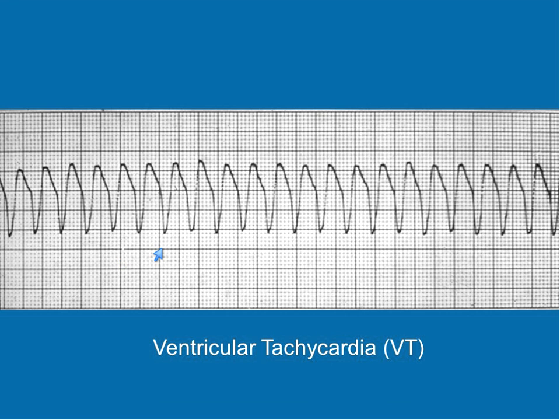If you see this monitor strip, you need to get up and check your patient. Your patient might be sitting in a chair totally oblivious that this is happening, that would be one end of the spectrum, all the way to unresponsive and pulseless. And you won't know that until you see your patient. If your patient is sitting in the chair and totally oblivious to this, I would say to that patient, I need you to take a deep breath and cough hard to see if you can get that to break. I need you to bear down. You're going to call to get the crash cart in there. You're going to check your patient's blood pressure. This is the patient who's awake.